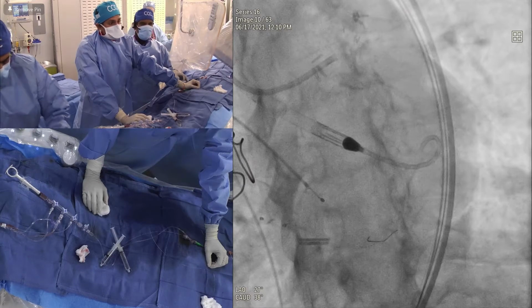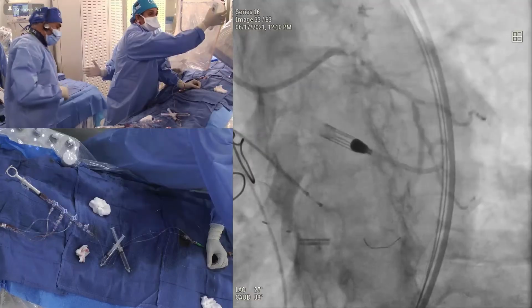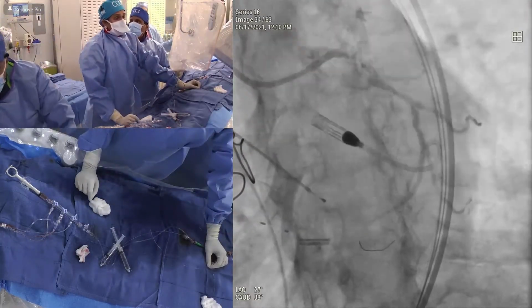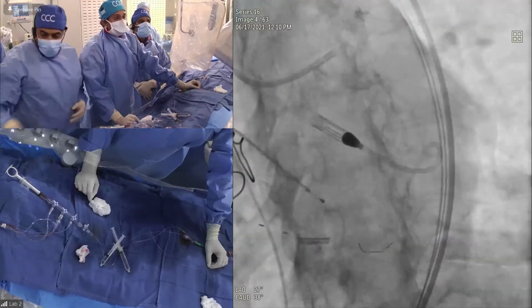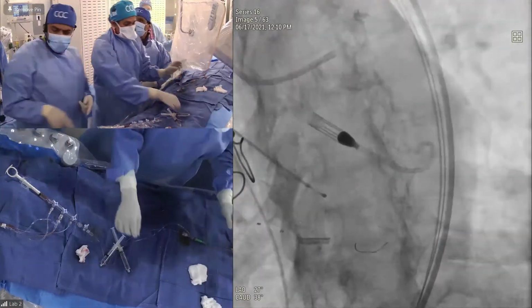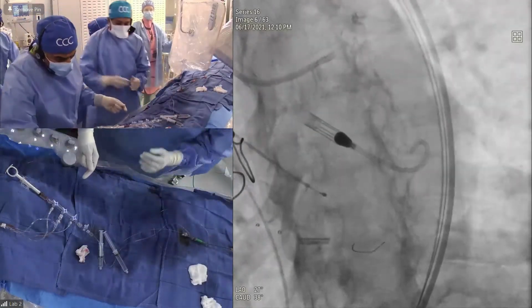That's what Anu is feeling: let's put a wire, let's put your balloon, and if it doesn't expand, you have a rotor wire there, so you upgrade to 1.5. I don't think we will go to 1.75 here. That's maybe 1.5. Roxana, can you see the proximal circ wire bias? Yeah, there's a lot of wire bias. So that's why I'm not too happy about going with 1.5. I mean, it's good if you could get away with the balloon, that would be great.